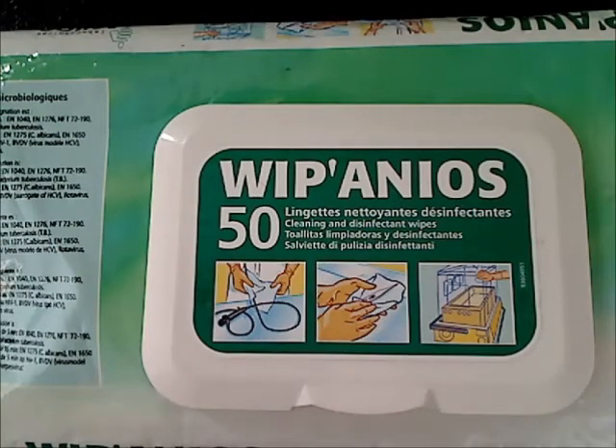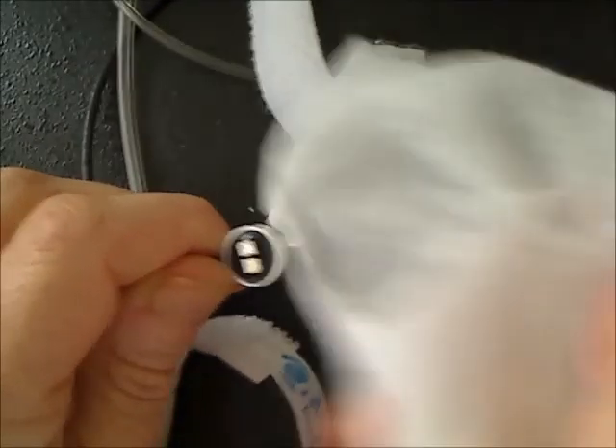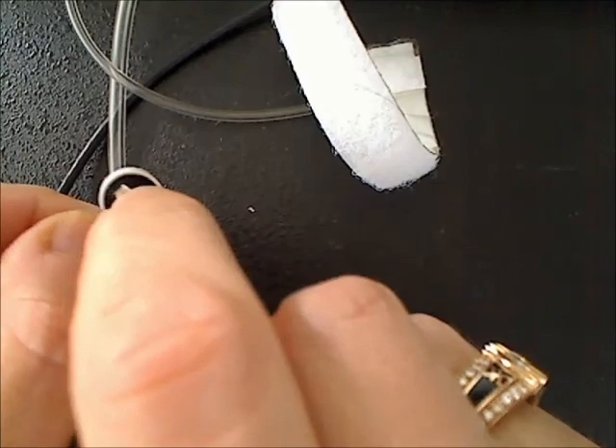Once the measurement is over, the cuffs and the sensor must be cleaned. To clean the cuffs and the sensor, you can use this kind of wipe. Just clean the cuffs, then the sensor. Before cleaning the sensor, the double-sided tape must be removed.